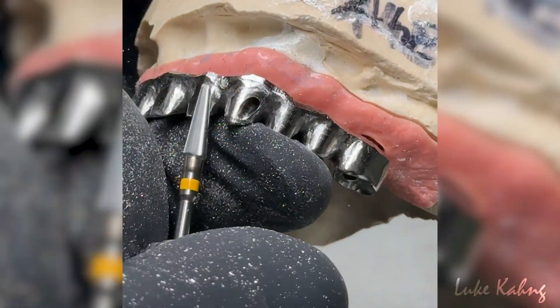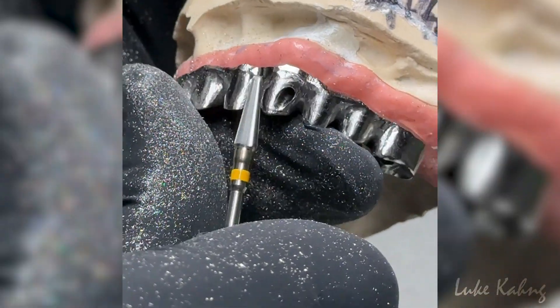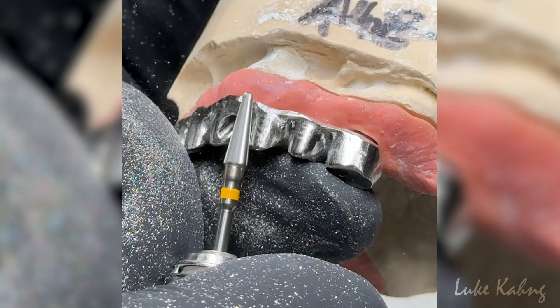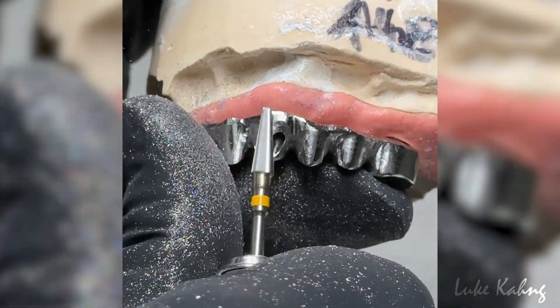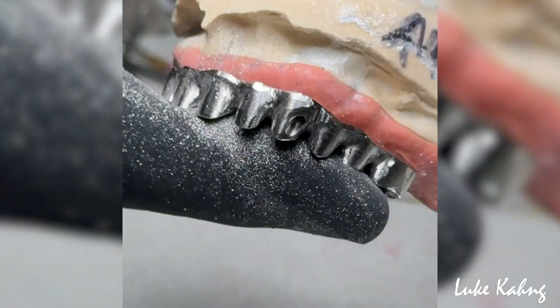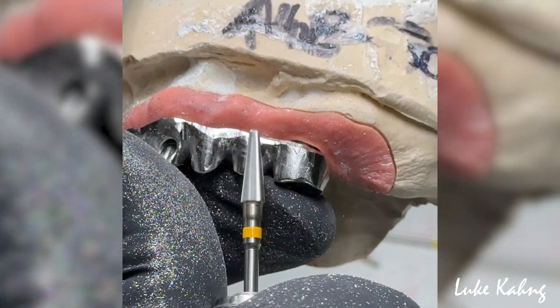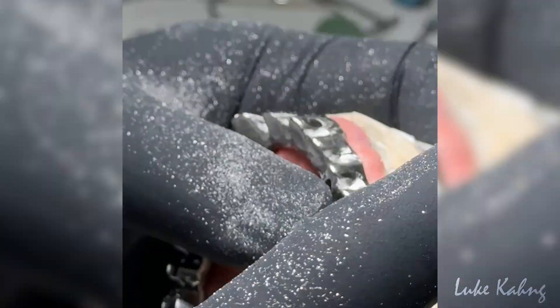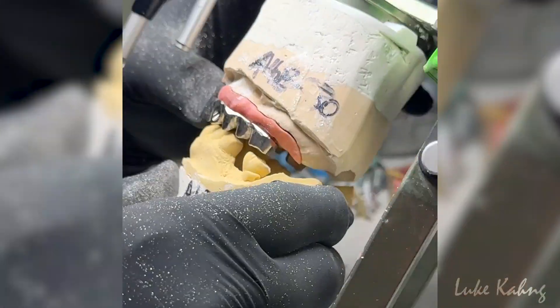Alignment — so here's alignment. I want indentation between the two, like here. And now this side. Whenever you look at the bite — I don't need half the size, I'm going to cut this much, because I can contour only here.